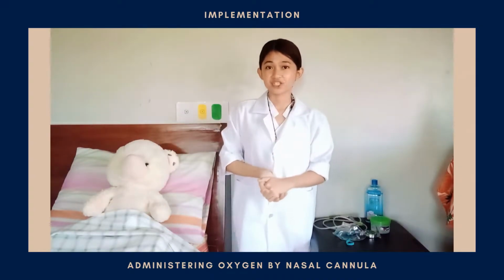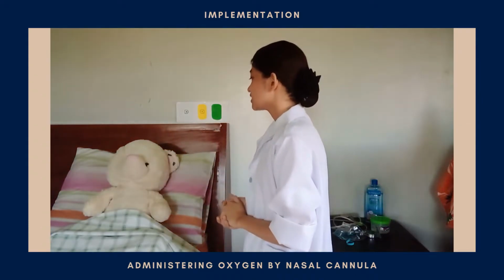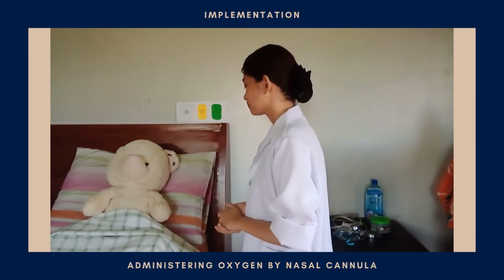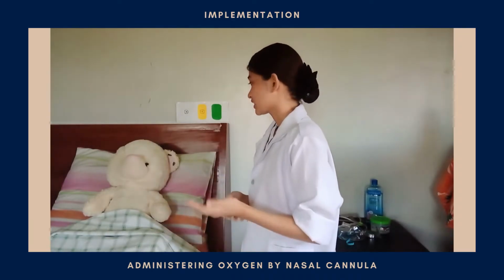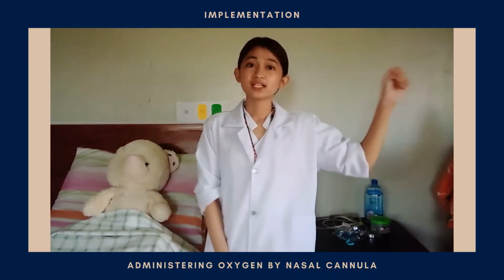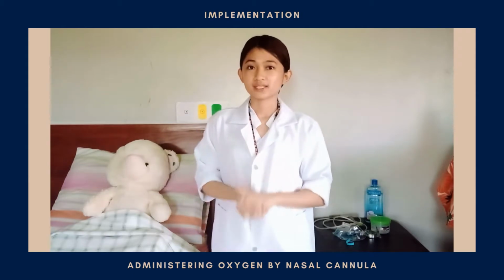Then, identify your patient. Good morning, ma'am. I'm Hanz Nicole from the NUST, and I will be your student nurse for today. May I know your name, ma'am? And your date of birth? Great, so would you like me to close your curtains and the door to the room to give you a little privacy? Then, close the curtains around the bed and close the door to the room if possible.